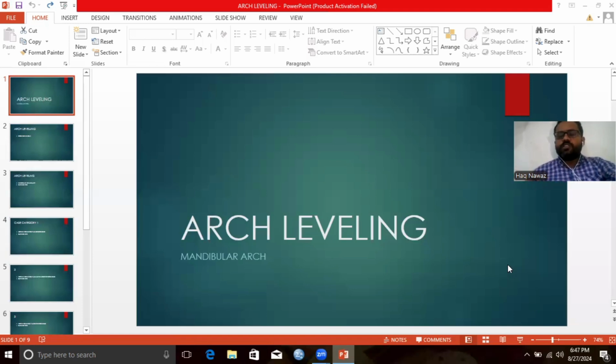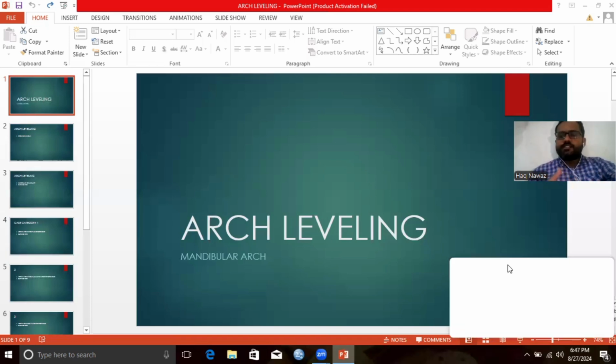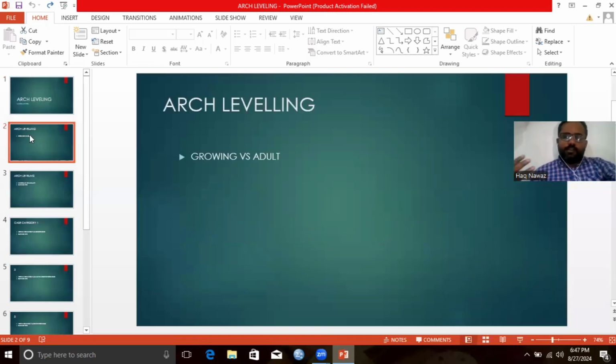This video is for the mandibular arch. For leveling in the maxillary arch, we will make a separate video. For leveling in the mandibular arch, first we identify the problem in the mandibular arch, which is the curve of Spee. Then we categorize the patient into two categories. Either our patient will be of growing age or an adult.